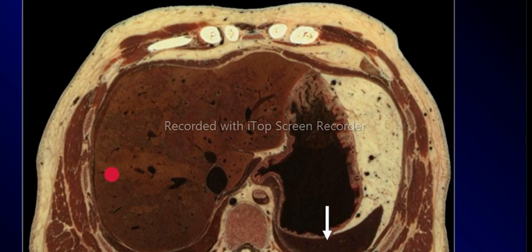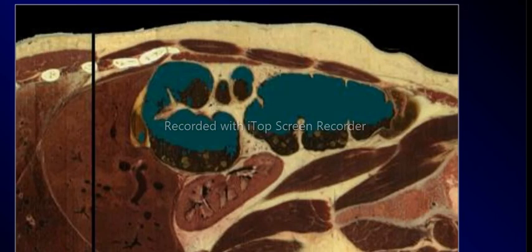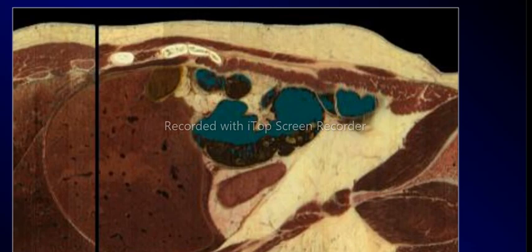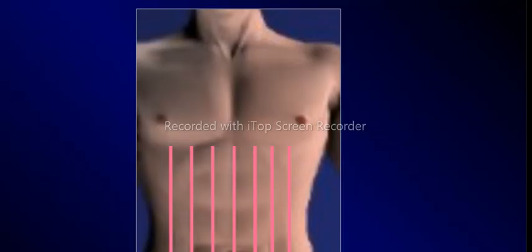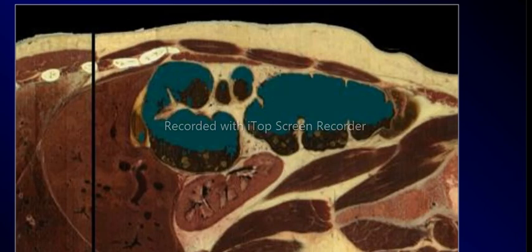I'm going to take you back to a sagittal image so that we can relate with this. I think this image is perfect, this one.